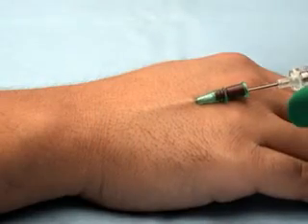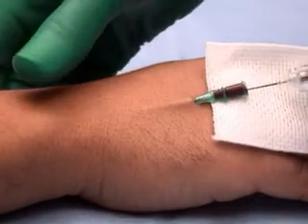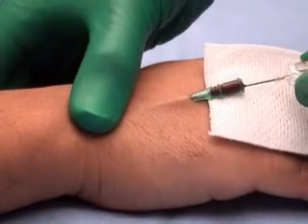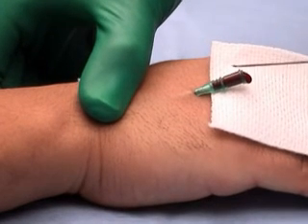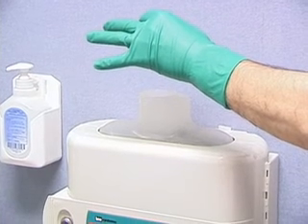To prevent blood loss from the open plastic cannula hub when the metal needle is removed, place direct pressure over the vein proximal to the end of the catheter and place a gauze pad beneath the cannula hub. Remove the metal needle from the plastic cannula and place it in the sharps container.